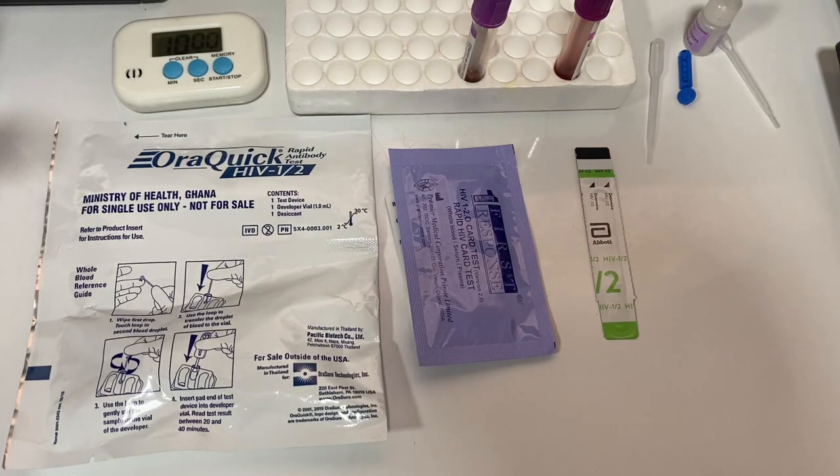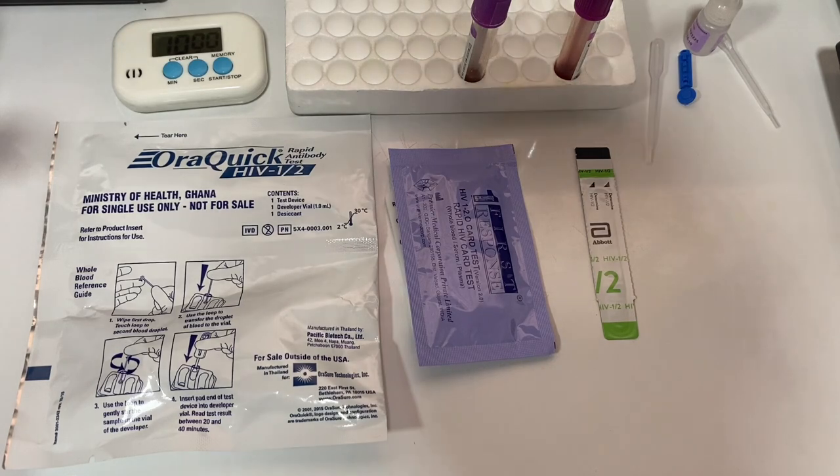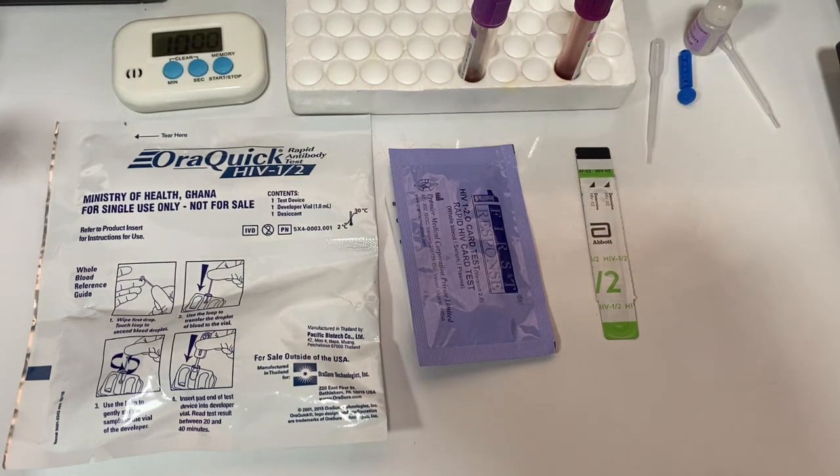Hello and welcome to this video. In this video, I want to learn how to use HIV 1 and 2 test strips to test for HIV 1 and 2. I'm hoping this will be a short video and a very comprehensive one.